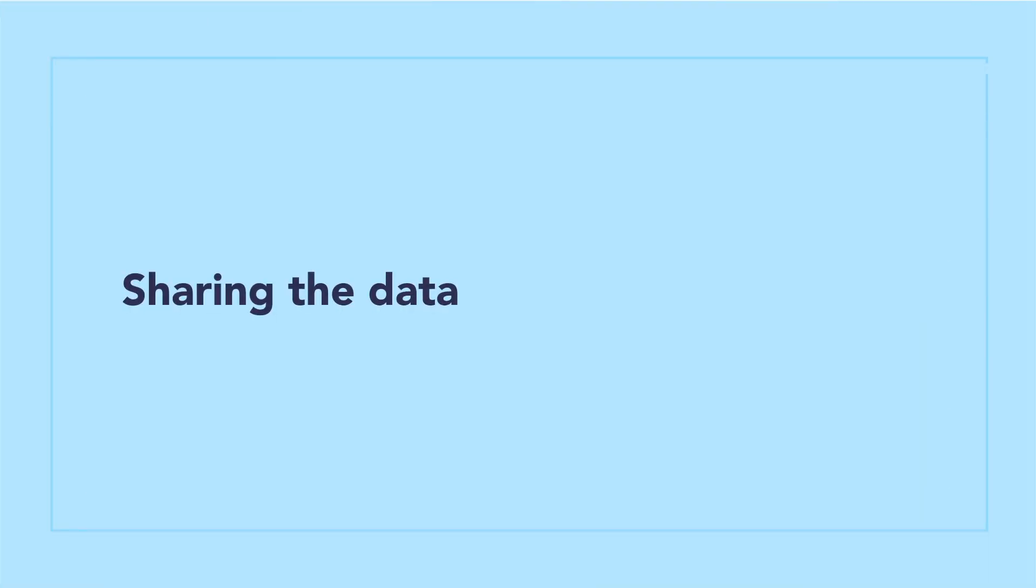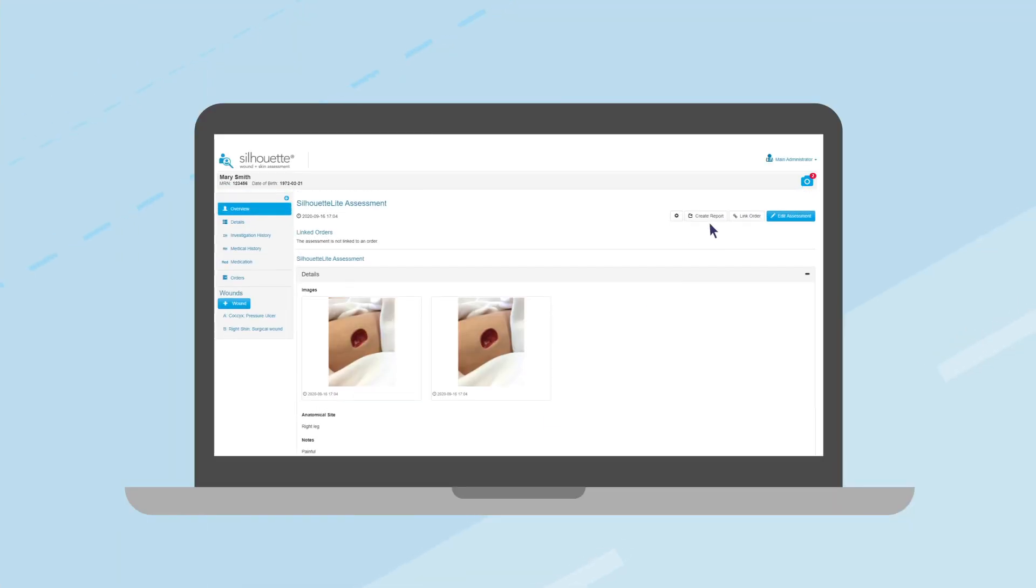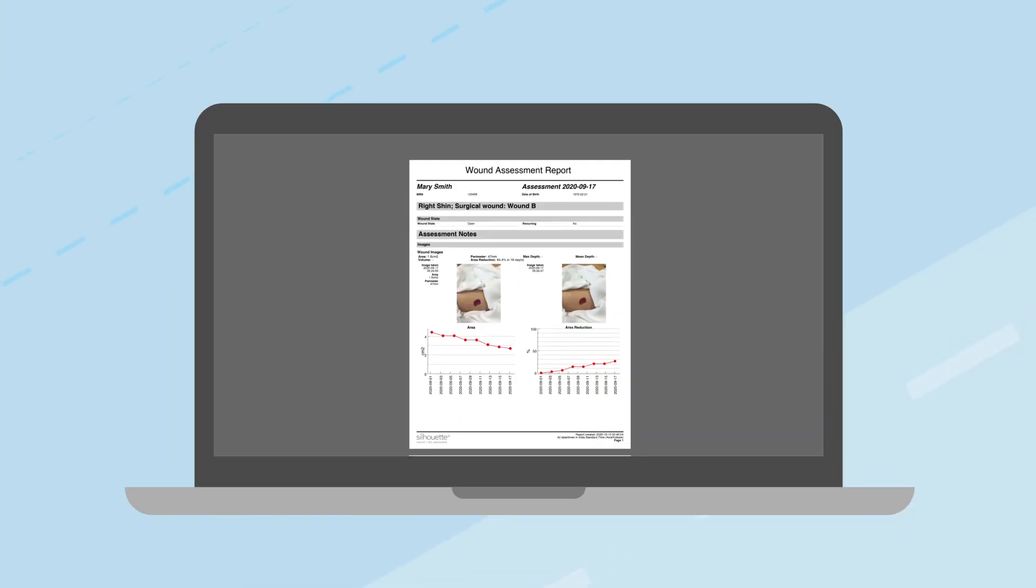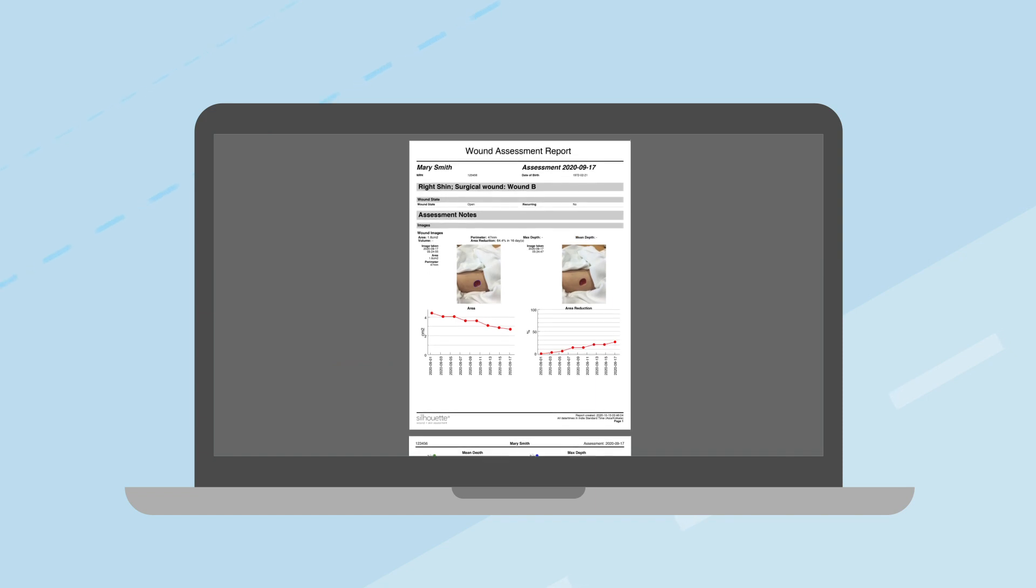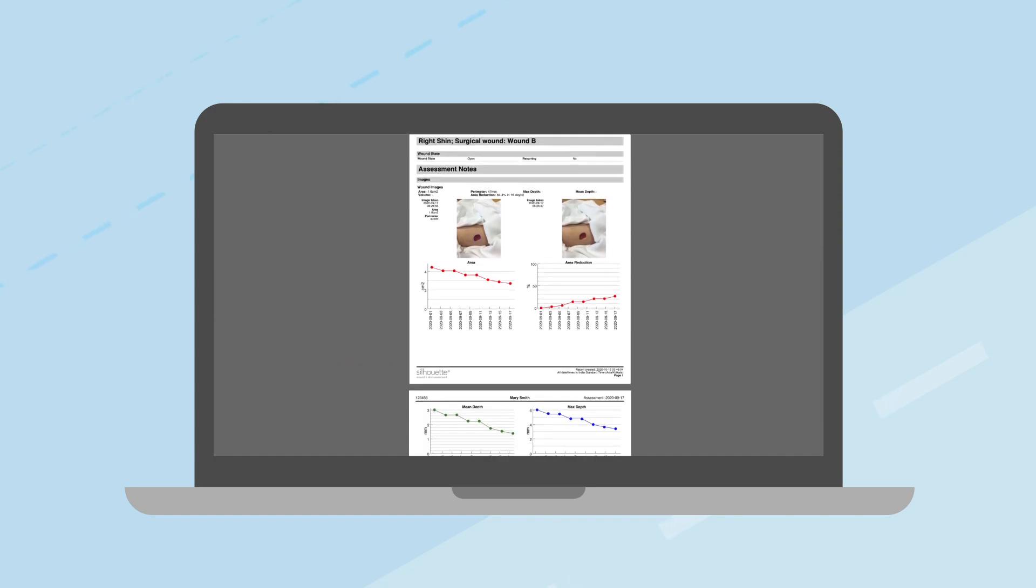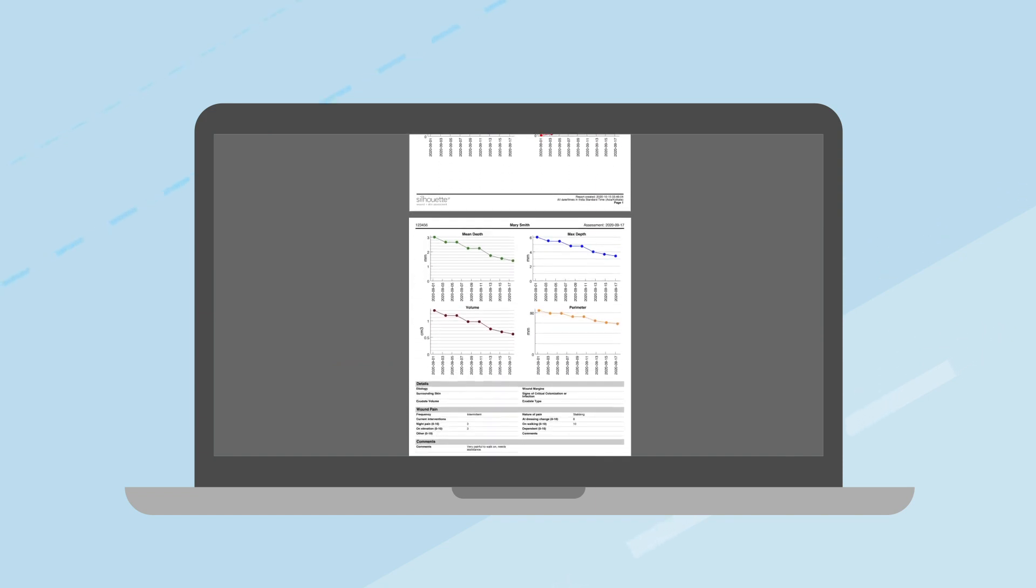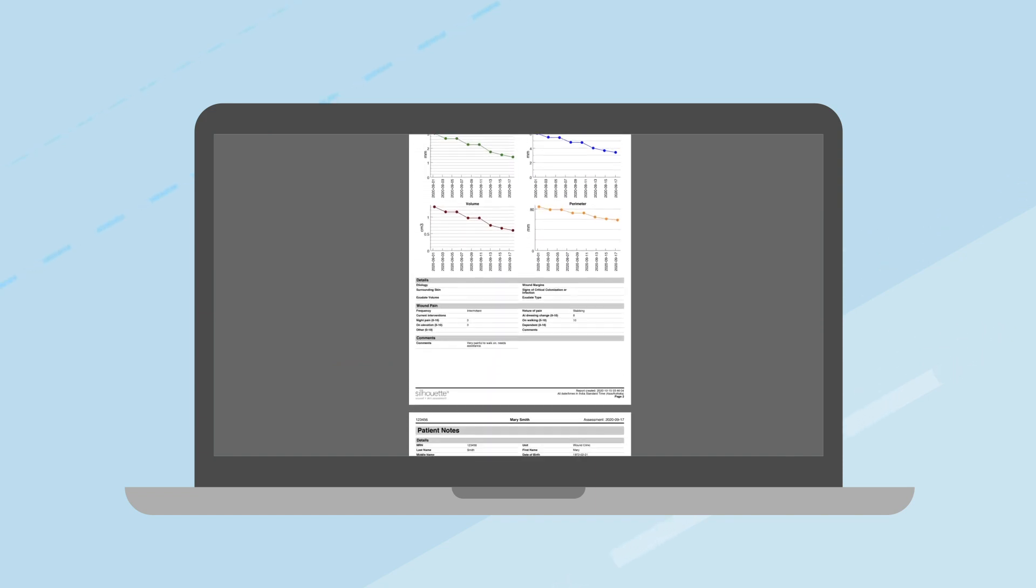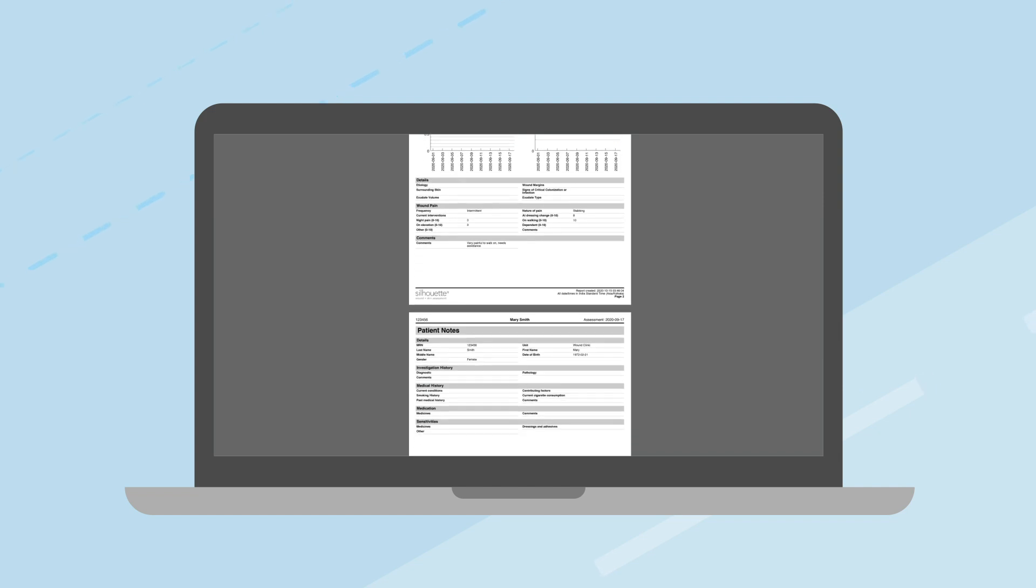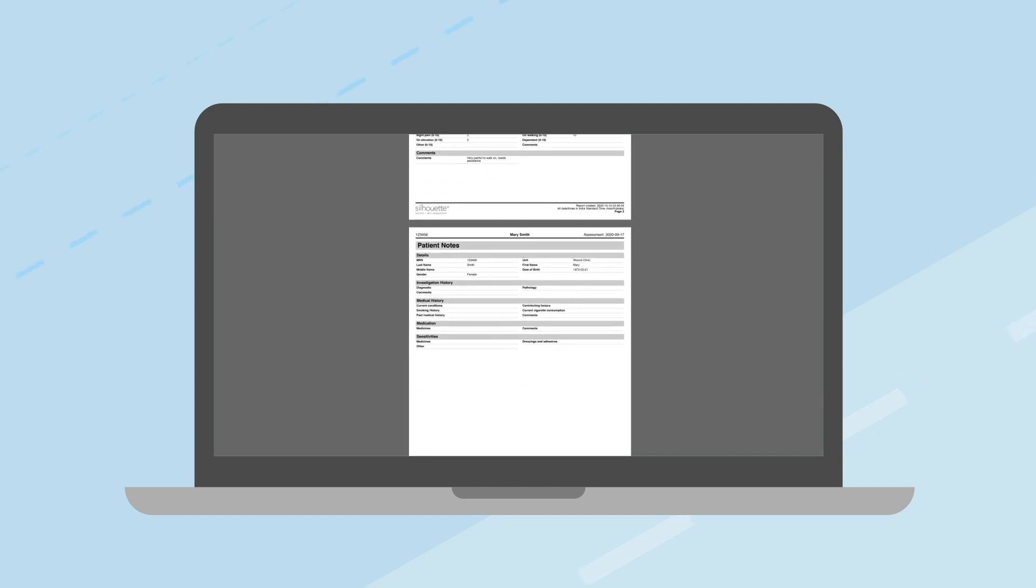The wound or skin images can be downloaded as PNG or JPEG files, and data captured in Silhouette can be turned into PDF reports at the click of a button, making it easy to share patient's healing information with other care providers.